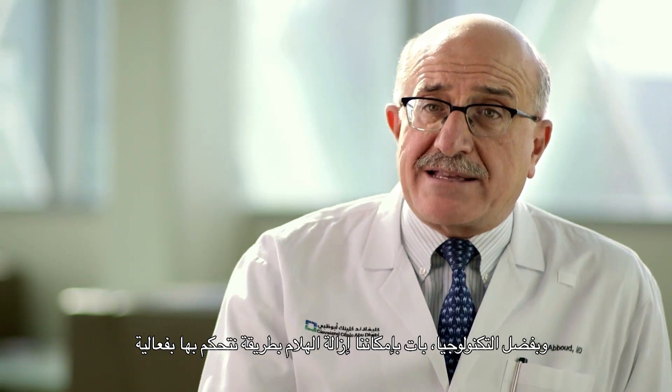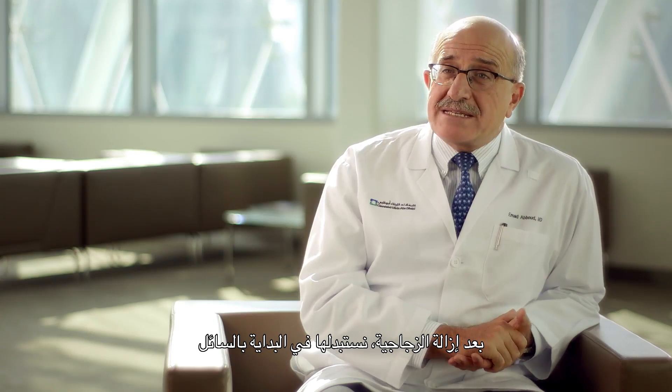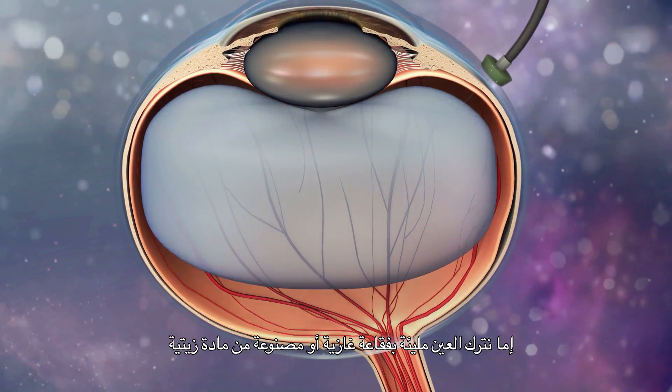Technology is extremely effective in allowing us to control every step of the procedure. After removing the vitreous, we replace it initially with fluid, but then at the end of the procedure, we either leave the eye filled with a gas bubble or with an oily substance bubble.